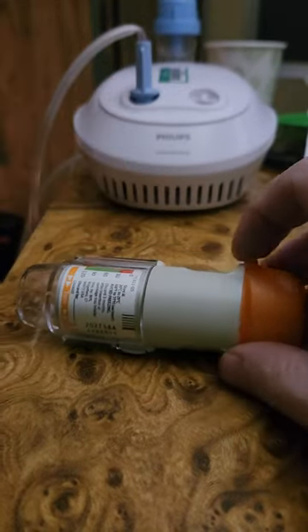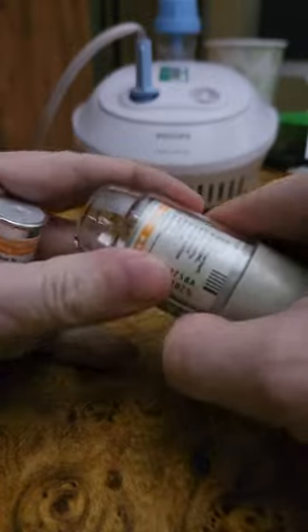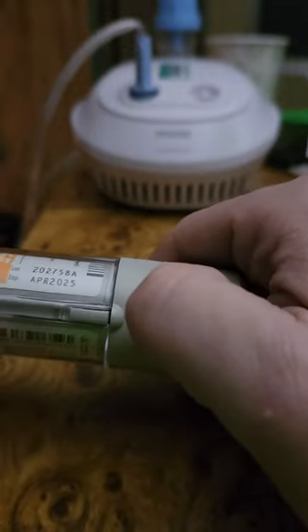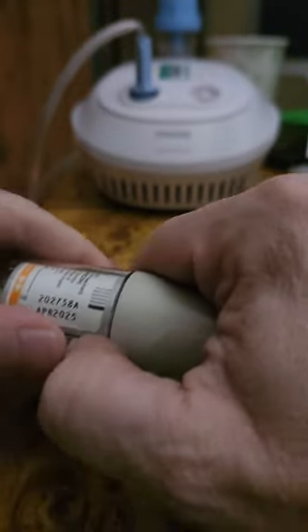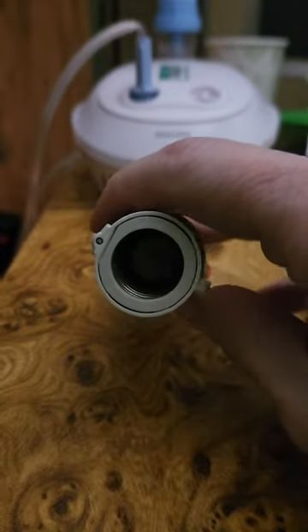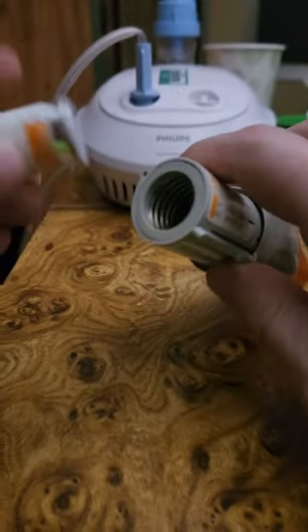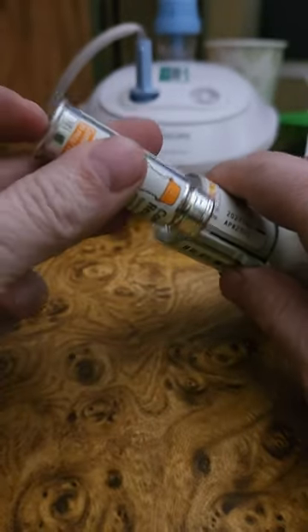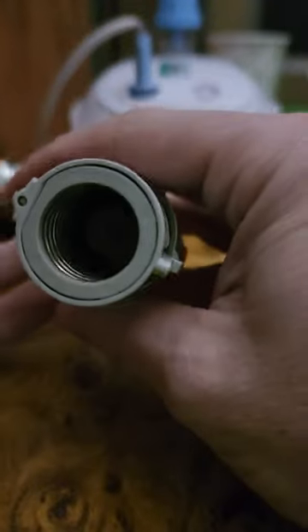Your pharmacist may or may not know how to use this, so this is a quick demo. There is a little gray button on the side right here — you push that and the little clear plastic piece pops off. You take this end and insert it down into the inhaler, and there's a little thing down in there.